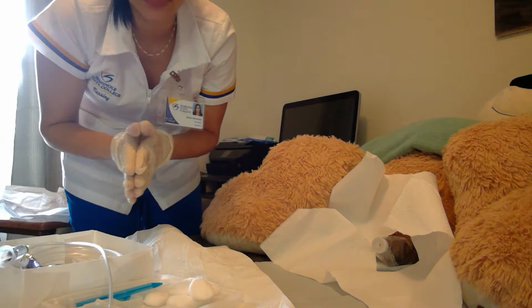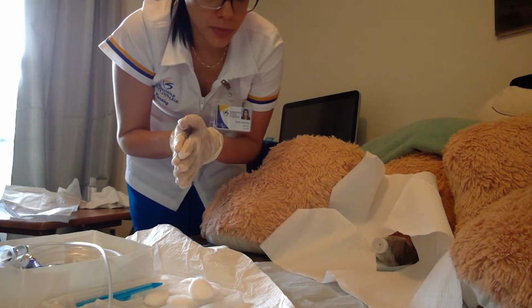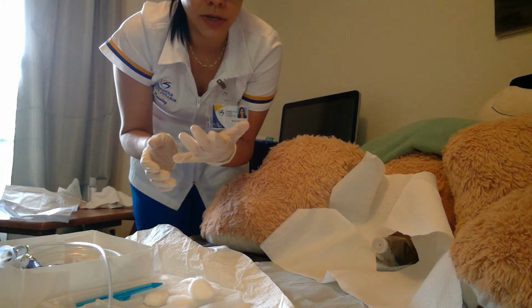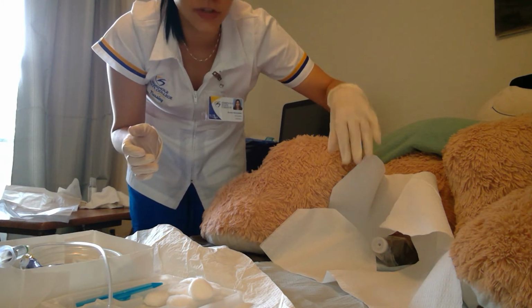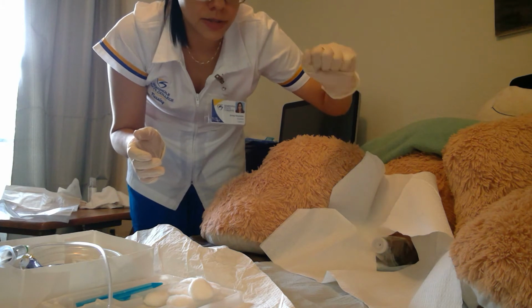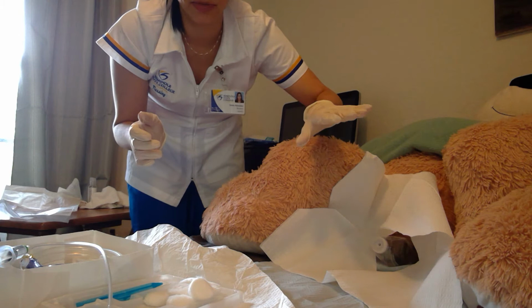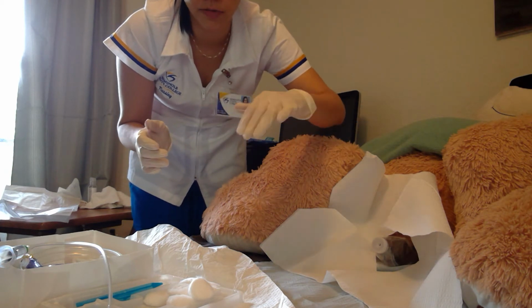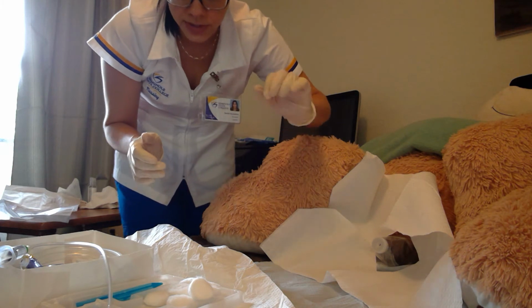All right, so the next steps are the most important steps. I am going to use my non-dominant hand to touch my patient's vagina, and now I need to realize that this hand is going to be contaminated and I cannot touch anything from my tray once I touch my patient with this hand.